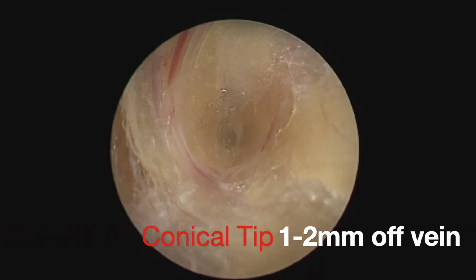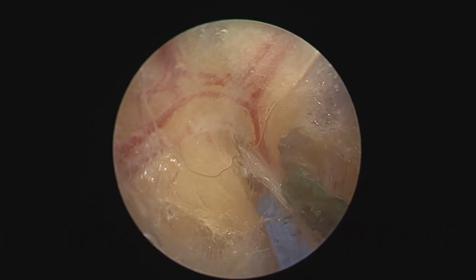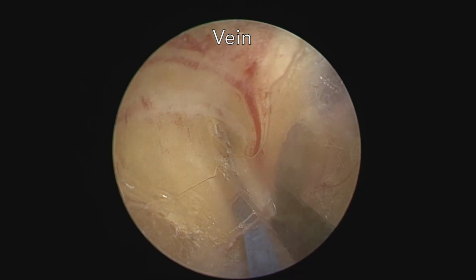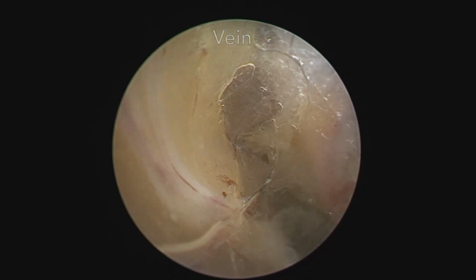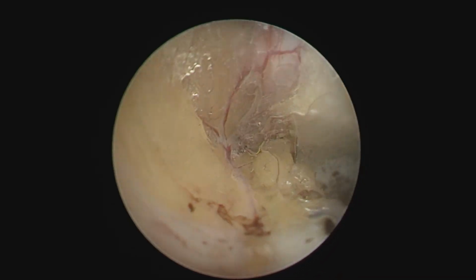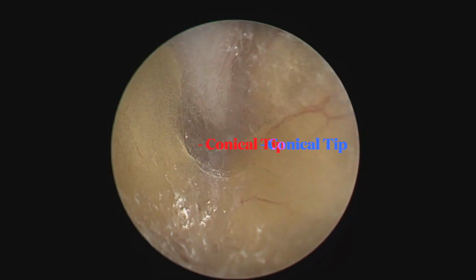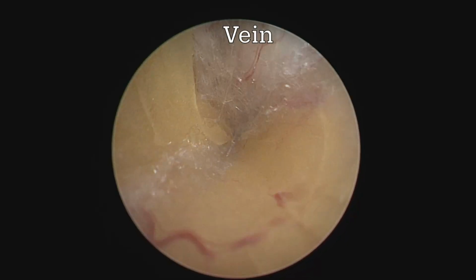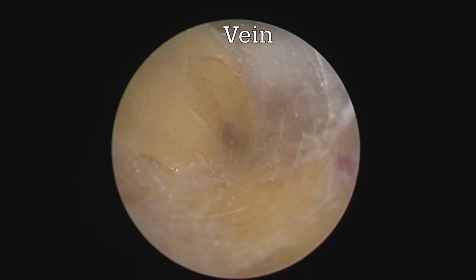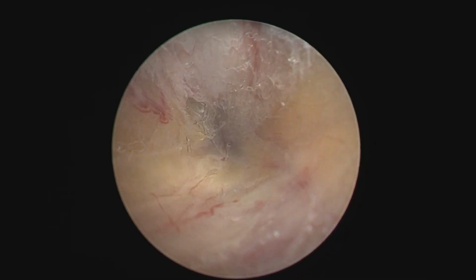Always keep your conical tip 1 to 2 millimeters off the vein and avoid stripping that adventitia from the surface of the vein. If you come across a small vessel, cauterize and cut, and then move on and continue your dissection. You don't want to place the tip right on the vein, but you want to be a little bit lower, a couple millimeters lower, and include just a little bit of fat and all the adventitia.